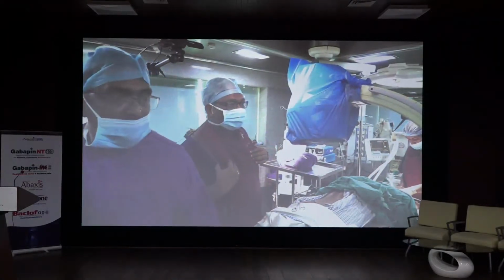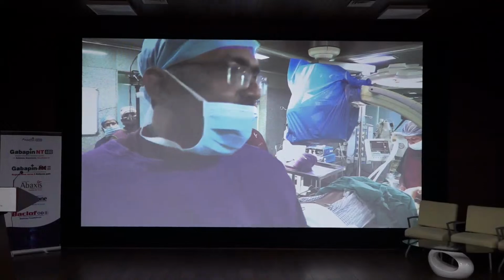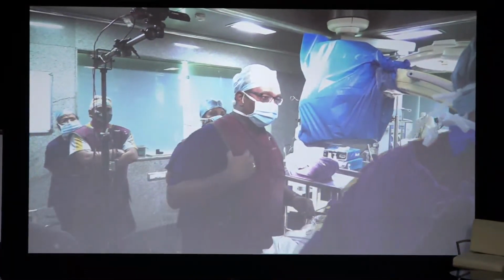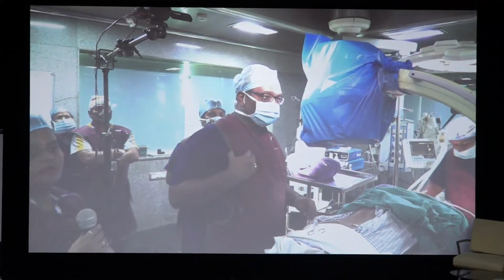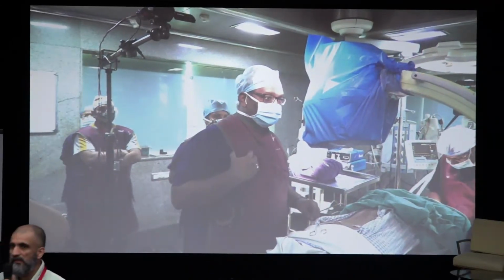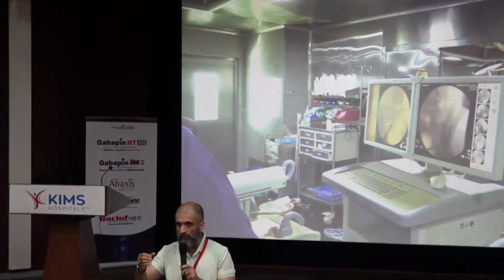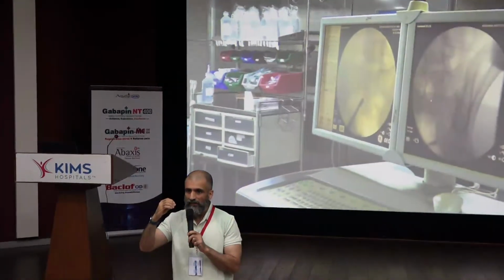They are trying to position the C-arm. Yes, sir. Now the point with the C-arm, which I always tell everybody, is that you should imagine the C-arm as your eye. For anything that you want to see, you have to see it like an eye.